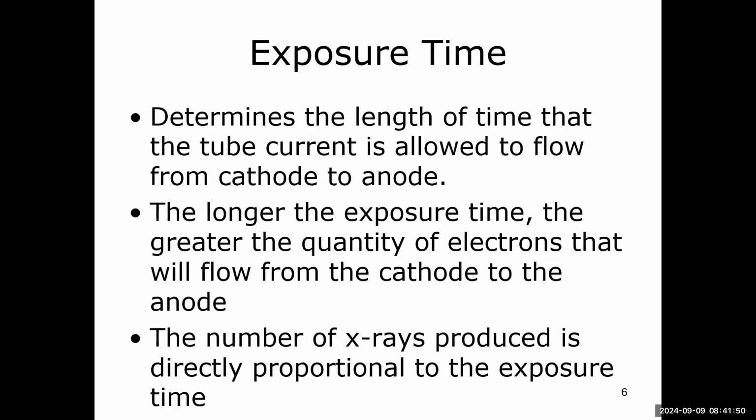So again, the number of X-rays produced is directly proportional to the exposure time. If the exposure time stays on twice as long, what's going to happen to your quantity of X-rays produced? It's going to go up twice as much. It's a directly proportional relationship.